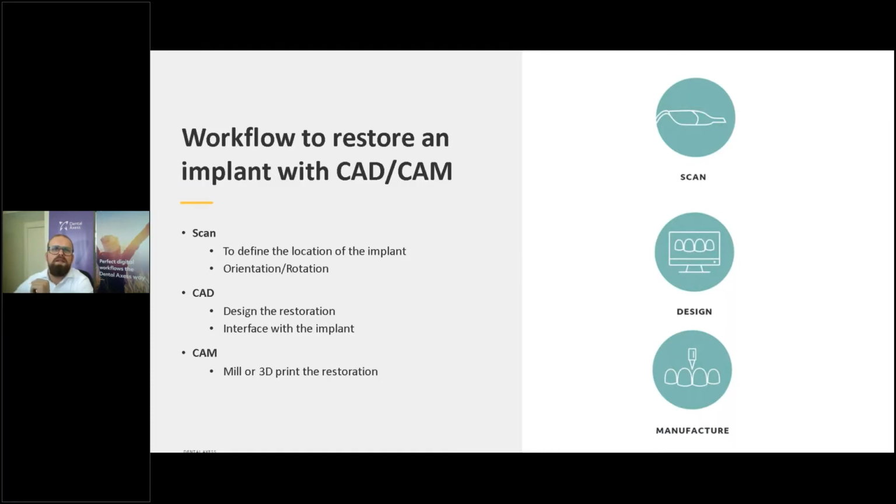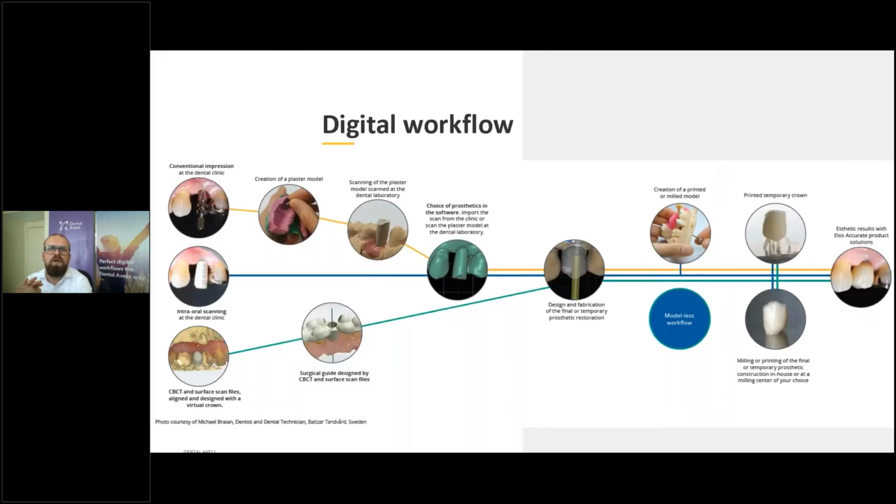I want to go a little bit more into detail, because what is the digital workflow? In fact, we have a conventional way, which is doing the normal impression with a pickup coping into an impression.